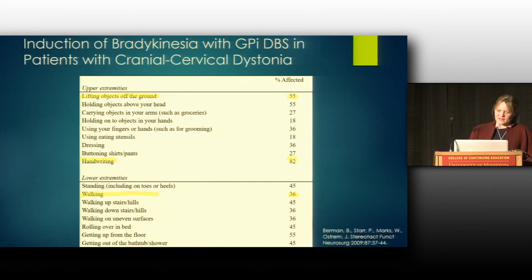So when I first met her, we could barely understand her because she had so many pauses in her speech from it. So we have just turned off the DBS here temporarily, and you can see her pull, and she can't even turn her head to the other side, and then we turn it back on, and she has improvement. But a couple more and we'll finish up.